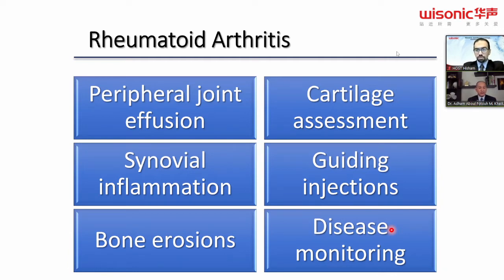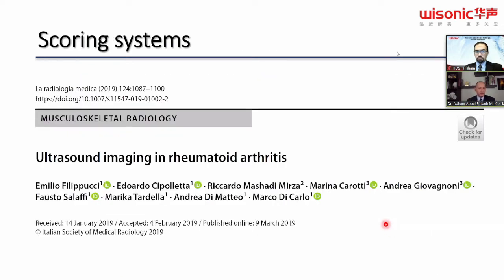I can do patient monitoring to set a start point for biologics, an end point for biologics. We can see subclinical synovitis in a patient in a drug-free interval. When he develops activity by the ultrasound, this predicts an inflammatory arthritis flare later on. So interfering earlier is much better, and so forth.